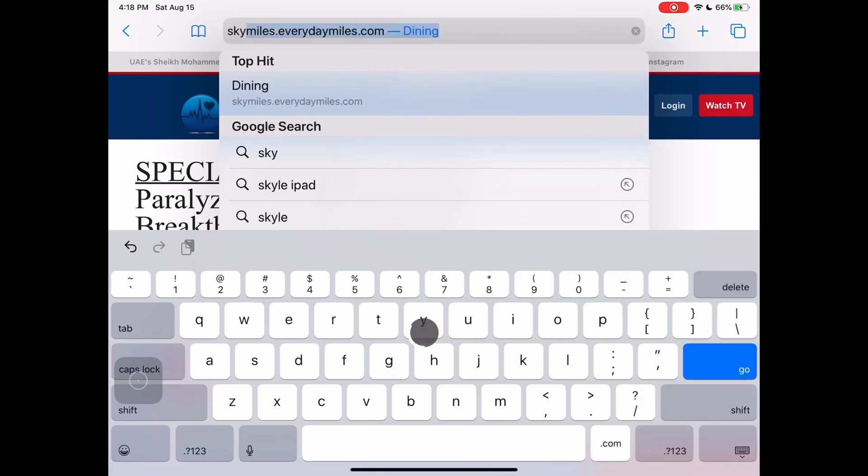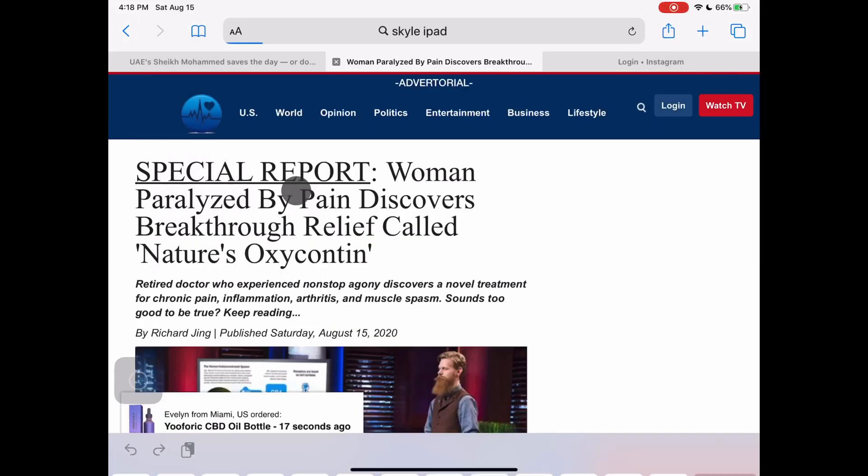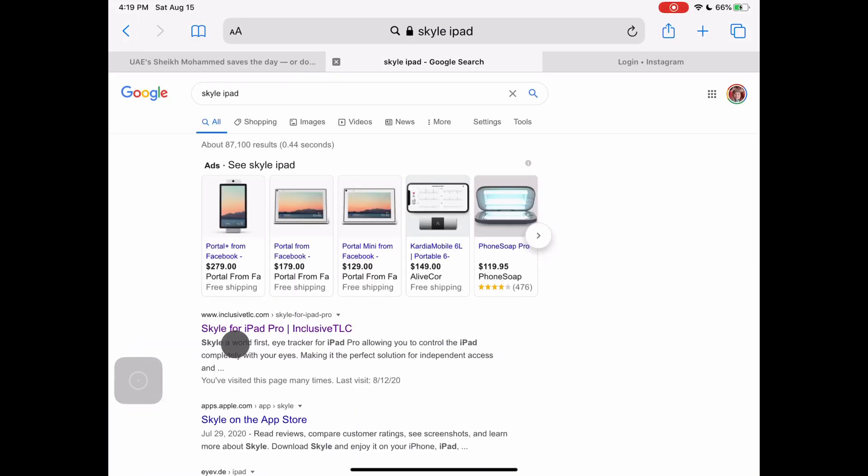Search for something using the search bar. Type in your terms. Choose the link to the page you want. And again use scroll down to review the page.